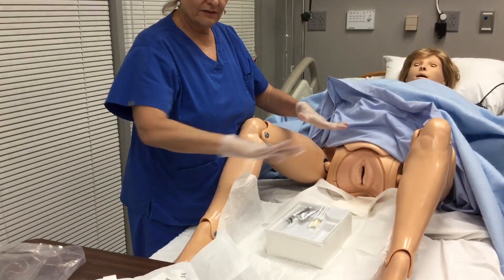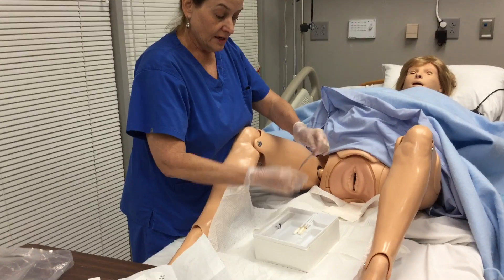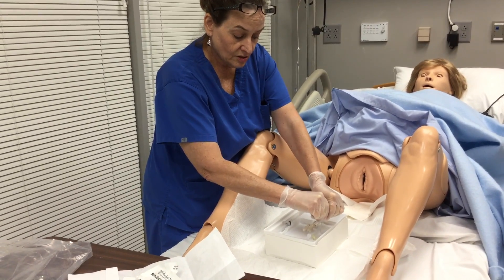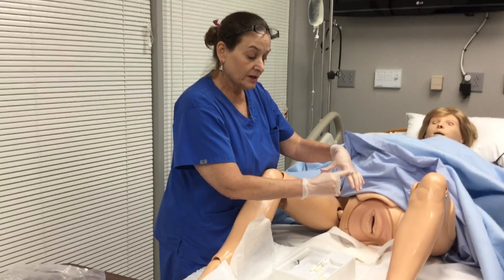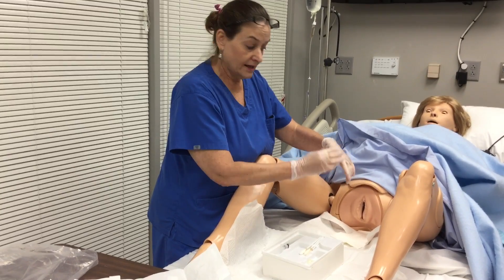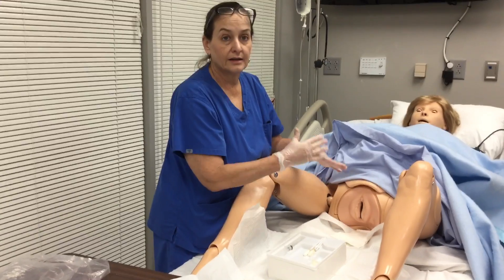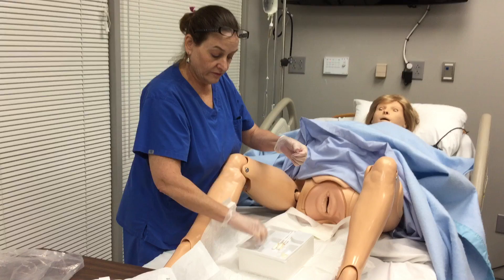I like to move everything out of my way that I am not using. Your KY Jelly you're going to open — in many kits it's in a syringe. Squeeze it into a part of your tray. Some people like to put the KY Jelly on the top of their hand that is considered the dirty hand, and then you can just dip the catheter into the KY Jelly right before you insert. It depends on what habits you develop. Maintain sterile technique and you will be fine. Take the cap off of your syringe.